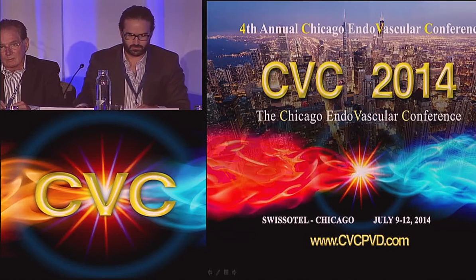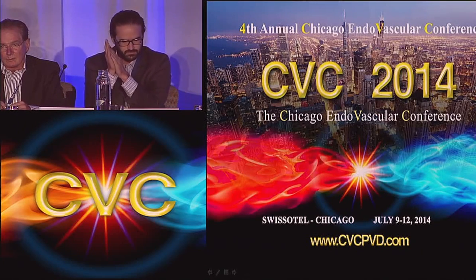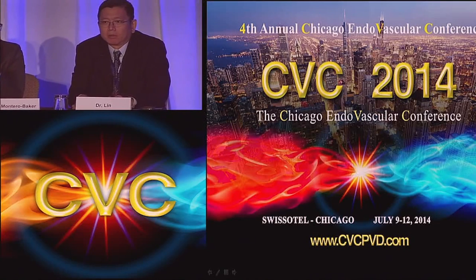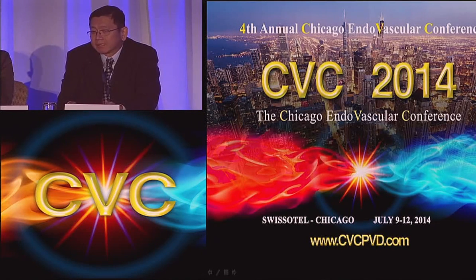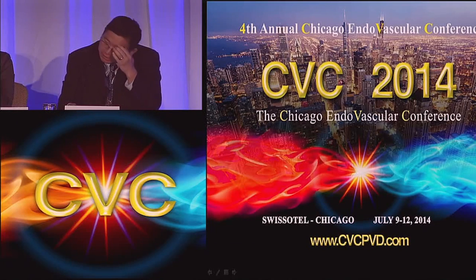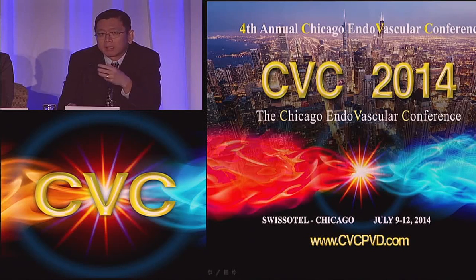It's a great question. Our treatment strategy has evolved somewhat over the years. Now we would routinely do echo at bedside. Just a word of caution, because the ECOS catheter does emit ultrasound, when you do a bedside echocardiogram, you do have to turn the machine off. Otherwise, you get a lot of conflicting artifact from the ultrasound energy wave. So for the moment that you're doing a bedside echo, you turn off the ECOS machine, but you can still continue with the lytic infusion.